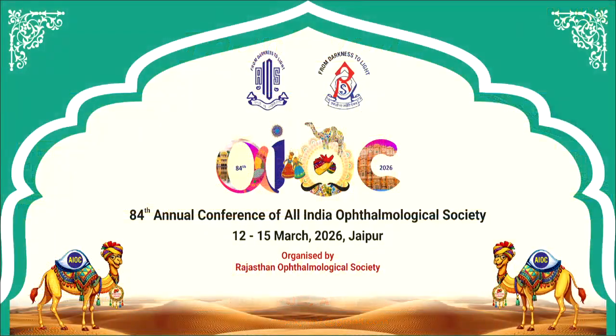So with the study of corneal and total eye aberration on iTrace or any topographic machine which gives internal aberration, we can choose an IOL which can match the eye, so that we can have a good quality of vision and good depth of focus.